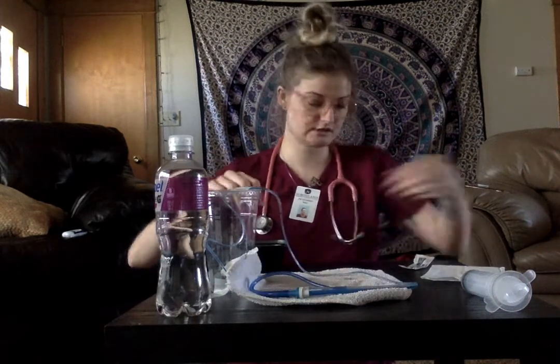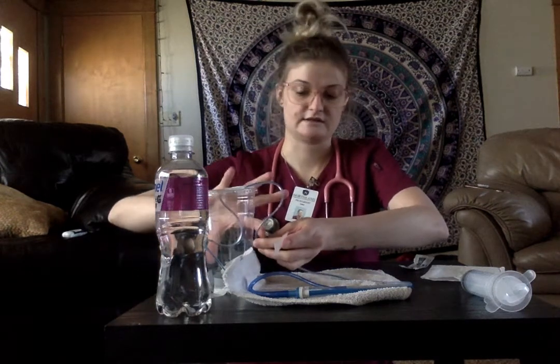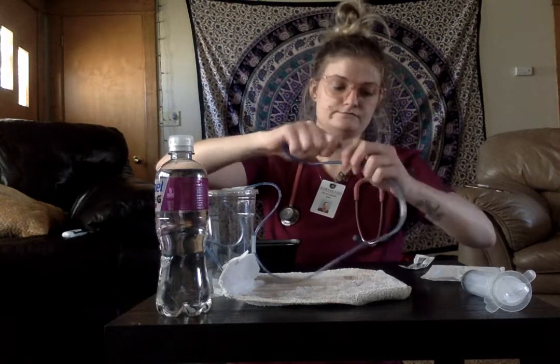So then as you do that, you want to secure it to your patient again. You want to make sure that they have enough room to look side to side and that they don't tug on their face every time they move, and that they have enough room. And you also want to secure it to their gown as well. So then you would also want to apply suction depending on what the doctor wanted it at. You would suction.